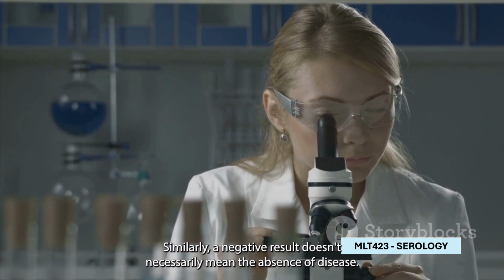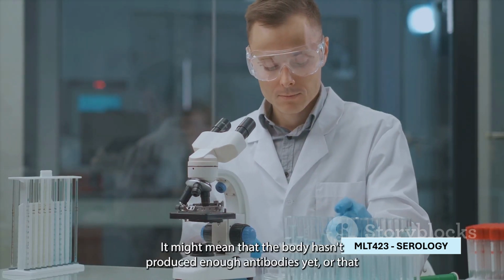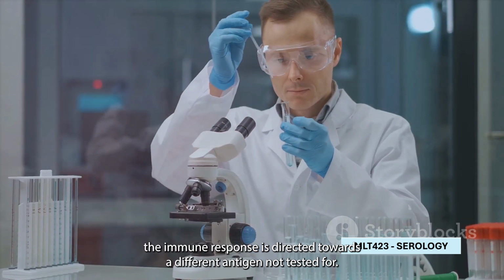Similarly, a negative result doesn't necessarily mean the absence of disease. It might mean that the body hasn't produced enough antibodies yet, or that the immune response is directed towards a different antigen not tested for.